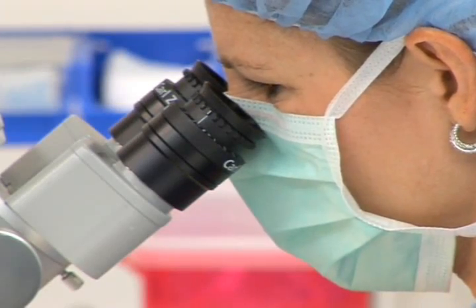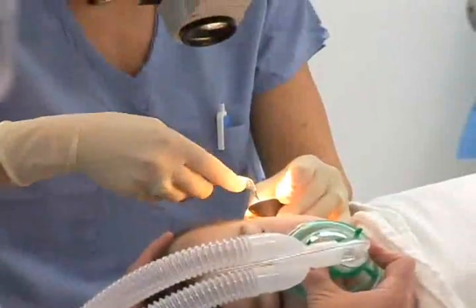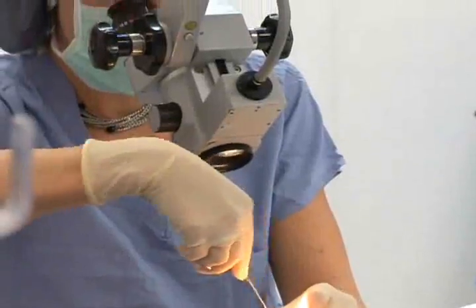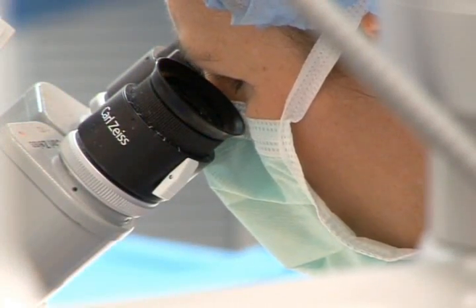A speculum is inserted into the ear canal in order to open it for visualization of the eardrum. There's oftentimes debris in the canal, such as wax, that needs to be removed before we can perform the procedure. Once we have the eardrum in good view, we choose our location to place the incision. Once the incision is made, the contents that are behind the eardrum need to be evacuated. We use a suction to do this. Once the contents are evacuated, we then are ready to place a tube.